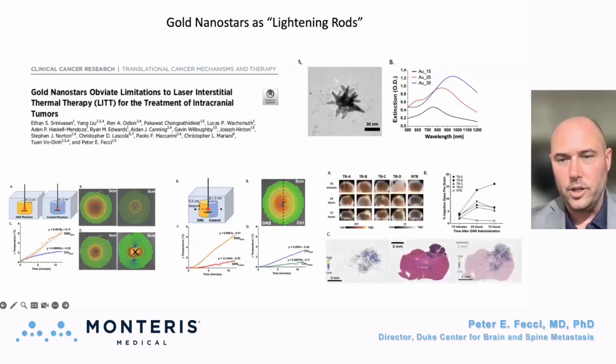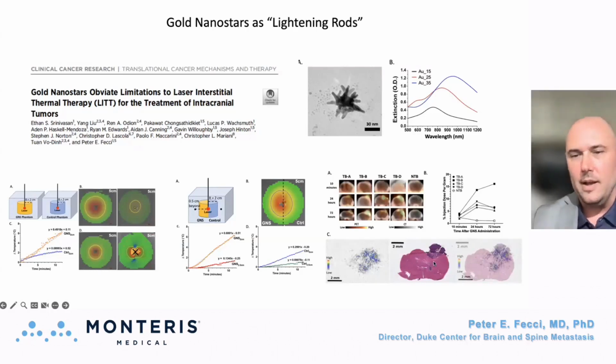Interestingly, these things will actually collect selectively in tumors. They behave almost like a contrast agent. And so we can get them selectively into a tumor, even if administered systemically, get the laser into those tumors, and get a very rapid, low-energy propagation of the heat to create a specificity for tumor at the border and minimize damage to surrounding eloquent areas. These are mouse tumors. We really need larger tumors if we're going to take this into a preclinical model that's relevant to the patient scenario.